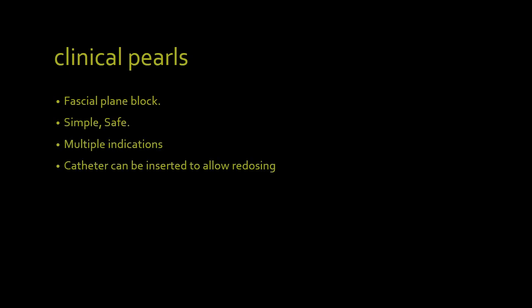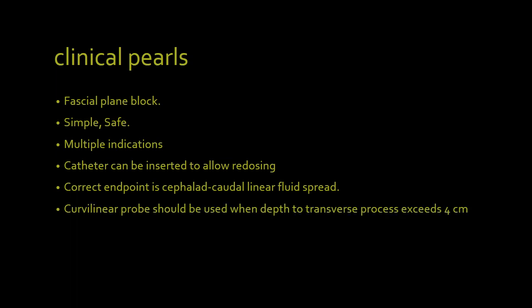Clinical pearls. It is a new fascial plane block which is simple, safe and has multiple indications. Continuous catheter technique can be used to allow redosing. There should be cephalad-caudal linear fluid spread during the block on ultrasonography. One should use a curvilinear probe in obese patients, and when depth to the transverse process exceeds 4 cm.